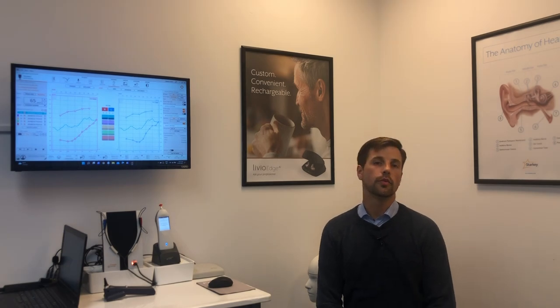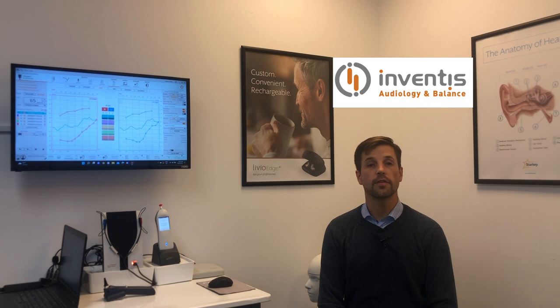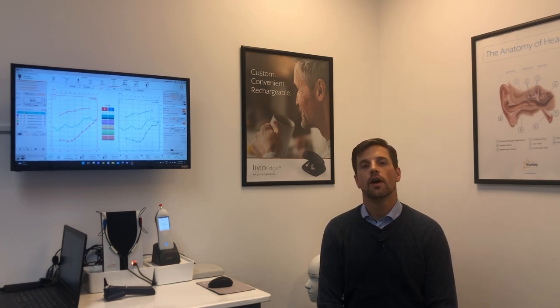I decided to go with Inventis, which is an Italian manufacturer that you may or may not have heard of. I went with them because they appear to make really quality stuff at a very reasonable price point, and gear that is just very portable overall.